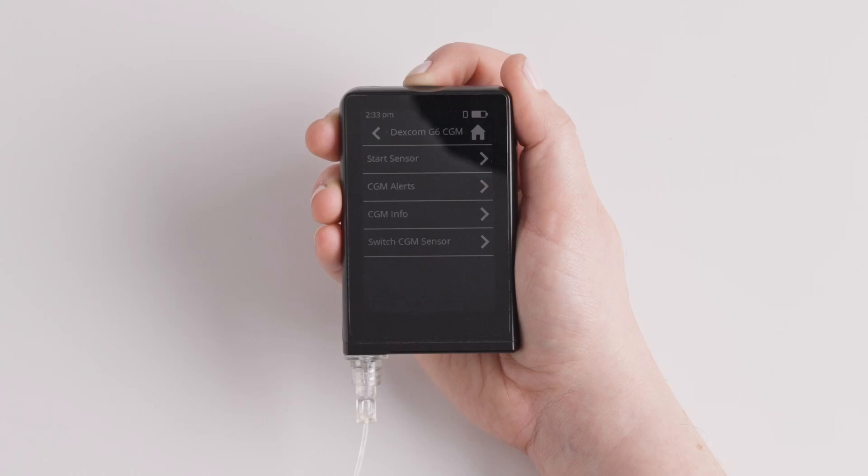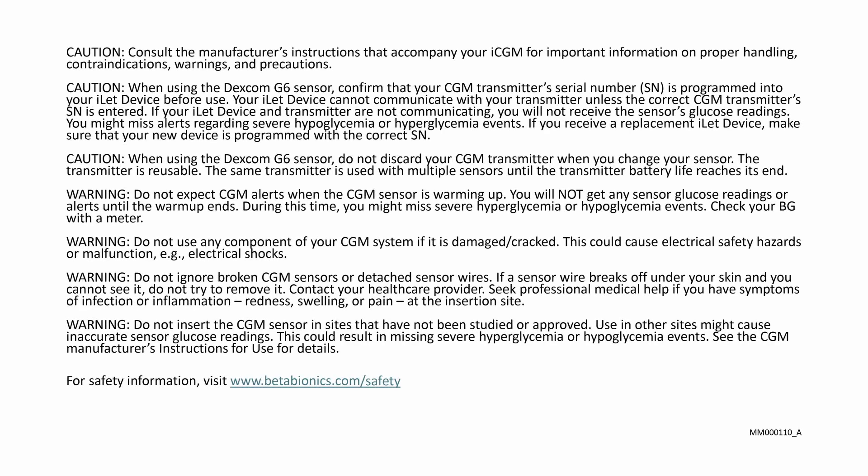Follow the workflow to start your new CGM sensor.